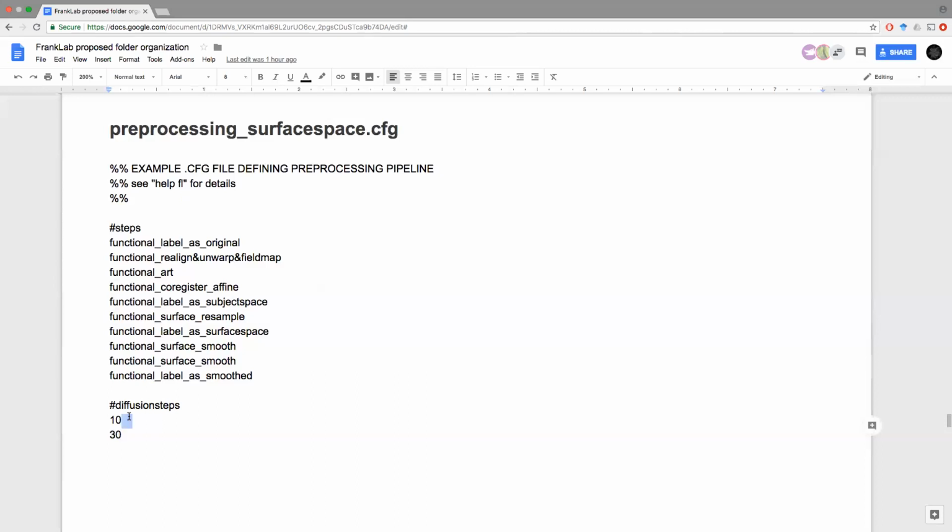I think the 8 millimeter smoothing for the volume data and the 40 effective steps of smoothing for the functional data is a reasonable, optimal level for the typical questions you want to ask. Only when you look at things like speech minus baseline, where you know you have more power than you need and you don't care about individual differences between conditions, you might want to look at unsmoothed data to gain a better sense of the spatial localization of those individual effects.